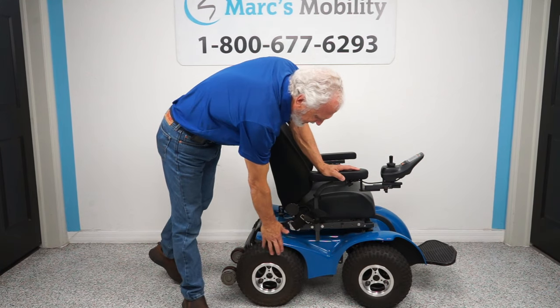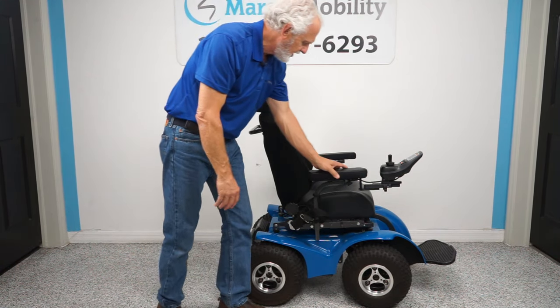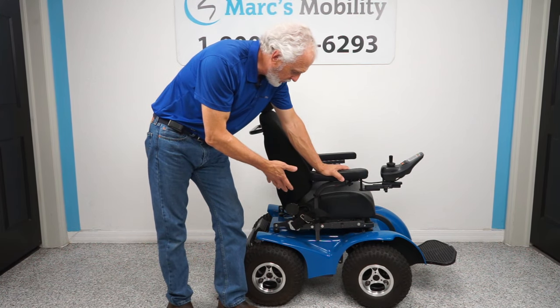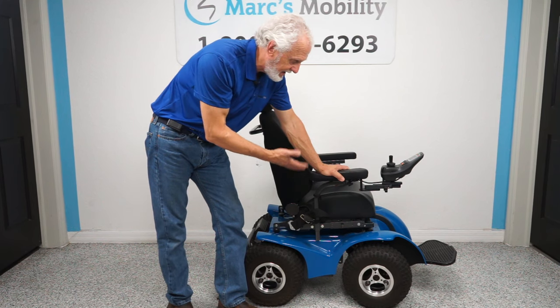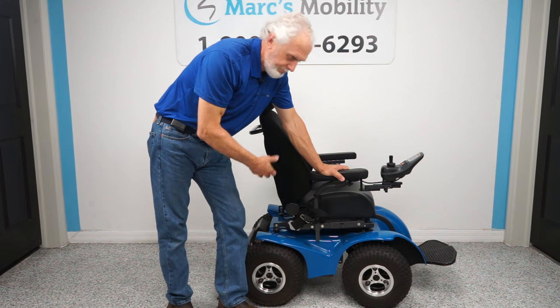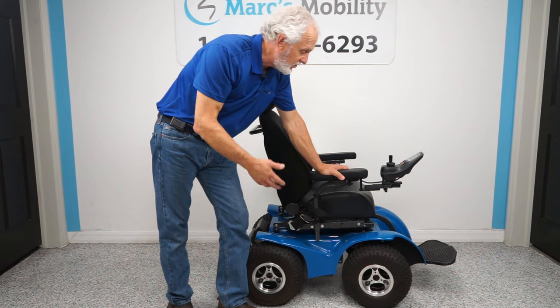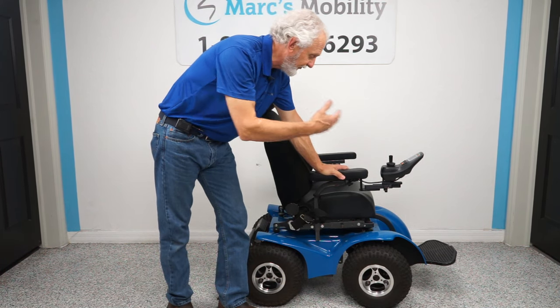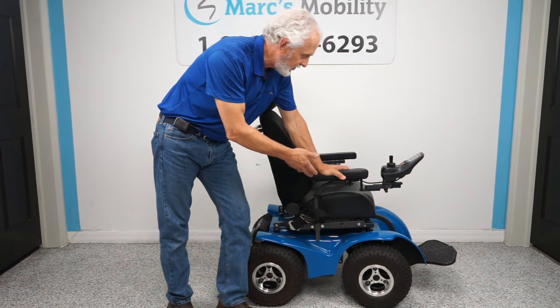These are air tires with aluminum rims — you want air tires for better ground traction. This is an X8 in blue. It was used; someone got a new chair so we got this one. Nothing is wrong with the chair. So if you're looking for a chair for part-time outdoor use — going to the beach once in a while, having fun — this is a great option and the price reflects that it's used.